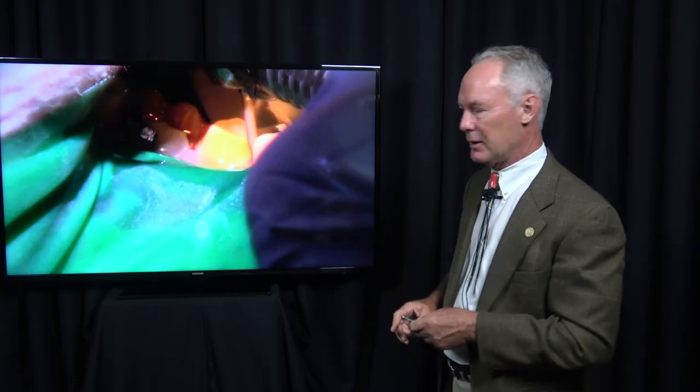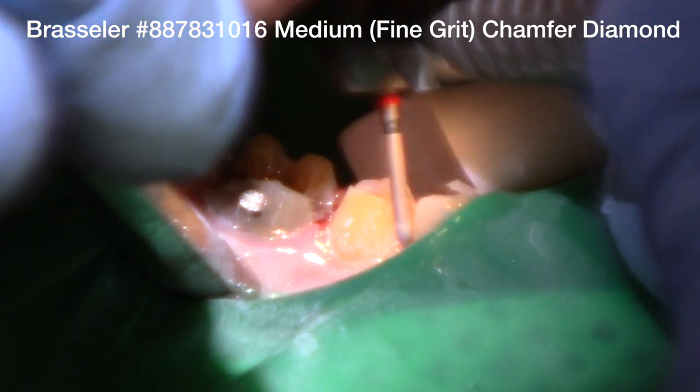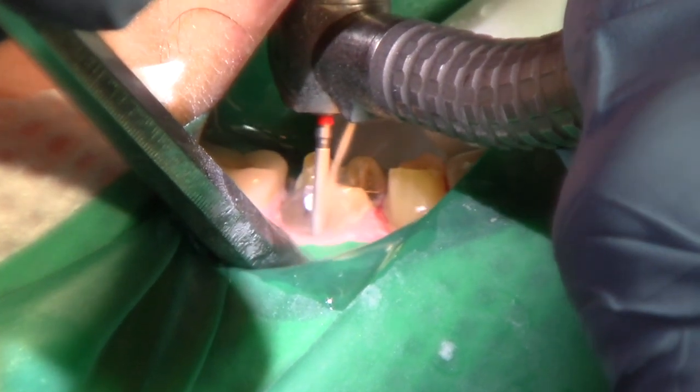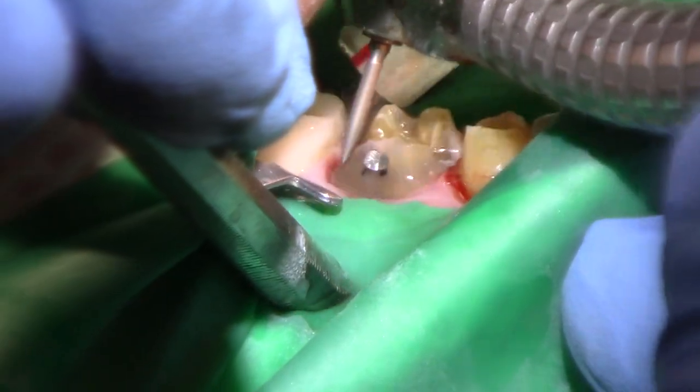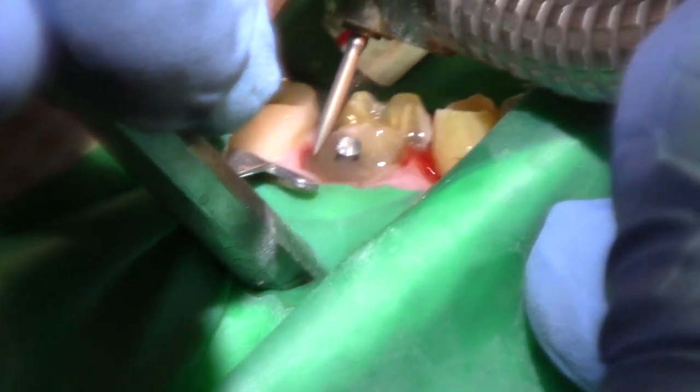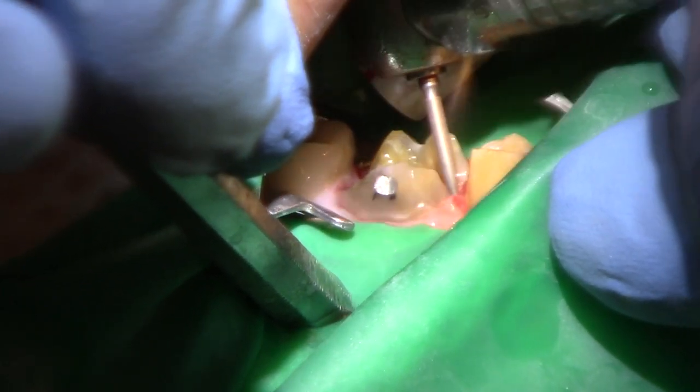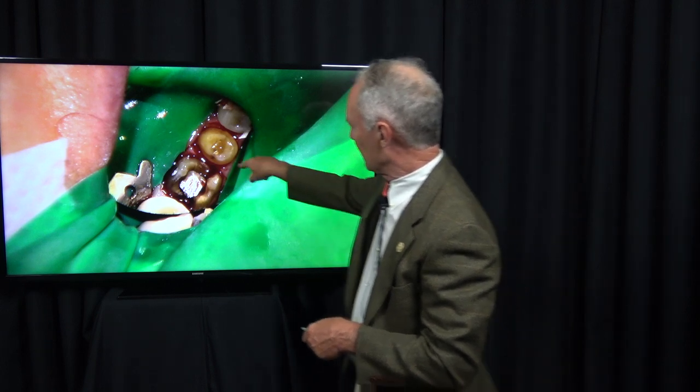This is a medium chamfered diamond, fine grit, and after I've used the barrel diamond for the bulk of the reduction, I'm placing my margins about a millimeter into the sulcus on the facial. Round all the line angles. You don't want any sharp line angles. You can see everything draws.